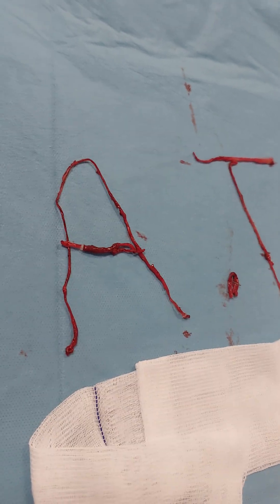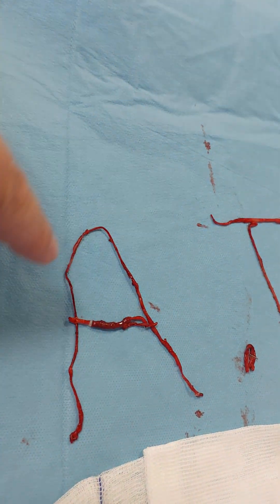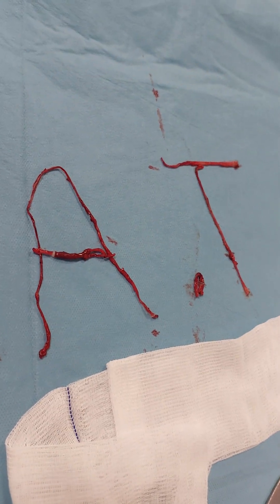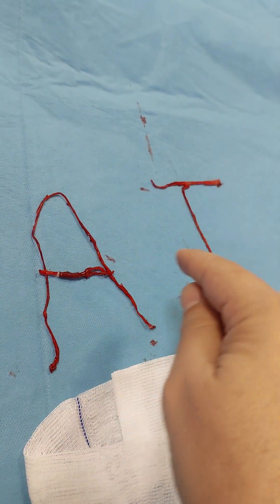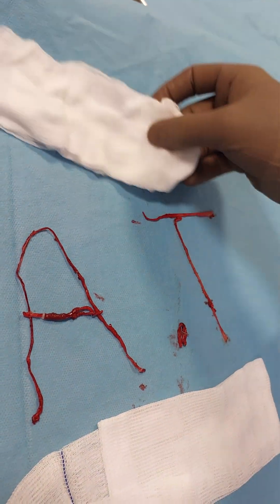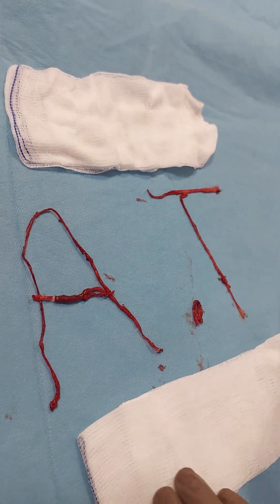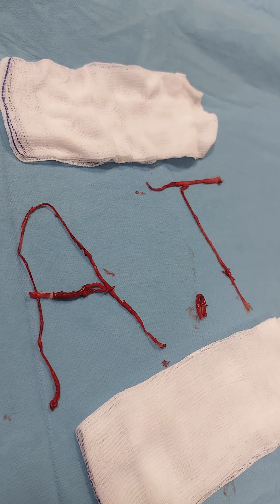This is just the left-sided varicocele, but we take out a lot of vessels. This was the external vessel, and these are labeled 'AT' — the initials of our patient. We have so many patients, so we write the initials when we can. These are the internal ones. This was the 15 cm external. This was an internal, this was an internal, and this was an internal vessel. So we take them out just to be sure that they are gone now.